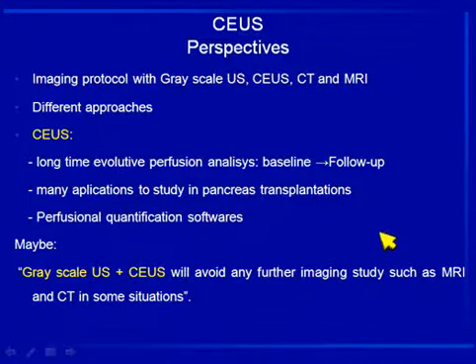We are very optimistic with the perspectives of contrast-enhanced ultrasound. We can develop an imaging protocol using grayscale ultrasound, contrast-enhanced ultrasound, CT, and MRI with different approaches. Contrast-enhanced ultrasound can be studied for a long-time evolutive perfusion analysis with baseline exams and follow-up.